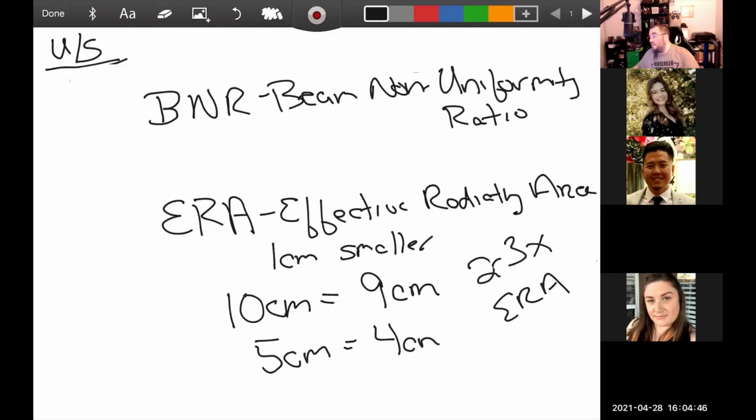So let's say I'm doing the low back again. Probably going to pick the bigger sound head, right? Unless I'm treating somebody like Stephanie, who's tiny. Might go with a smaller sound head on her because she's got a little bit smaller of a body. And that's going to determine, if I'm only treating an area like this big on her, then I need the small sound head. If I'm treating the whole low back, I can still go with the big sound head, even though she's small, just because I'm treating a larger area.